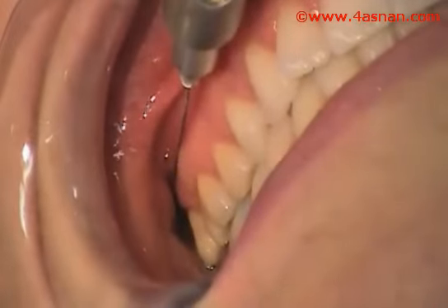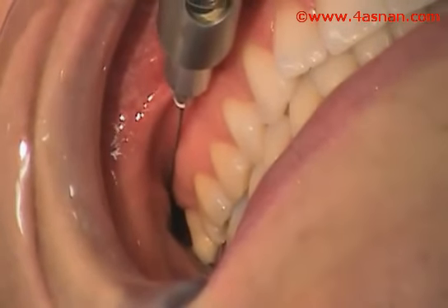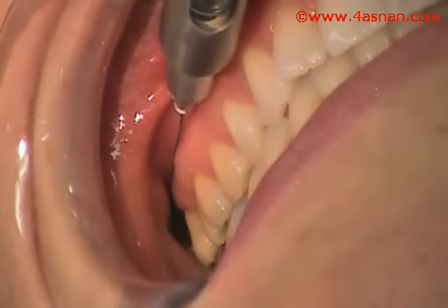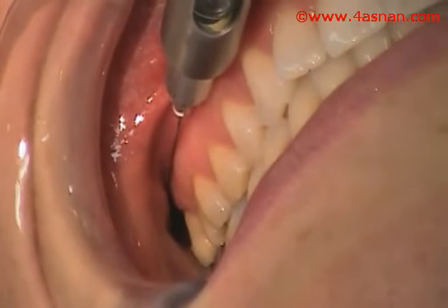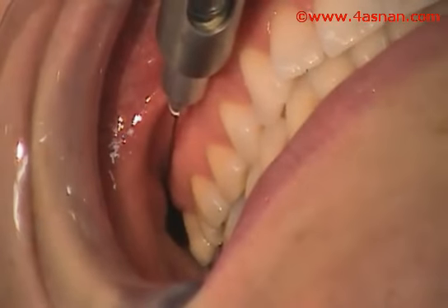Advance the needle 25 millimeters into tissue. Aspirate, and if negative, deposit 1.5 to 1.8 milliliters over approximately 60 seconds.